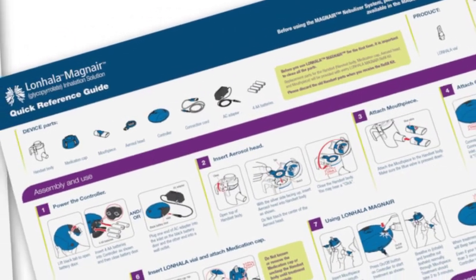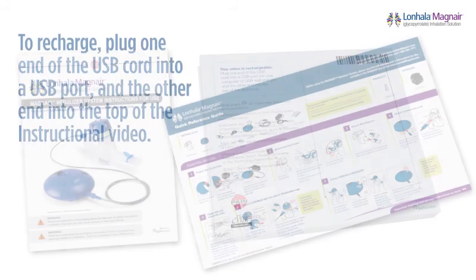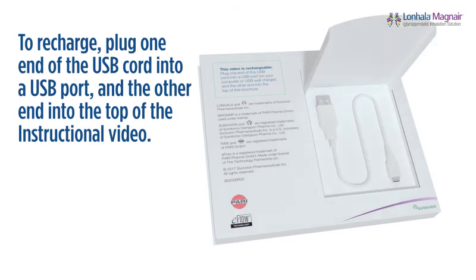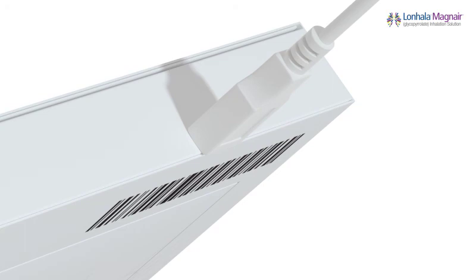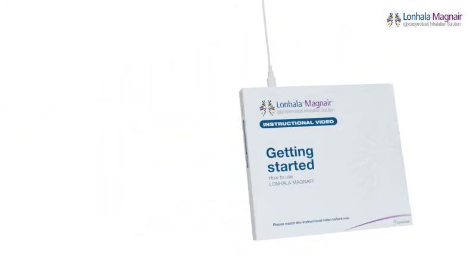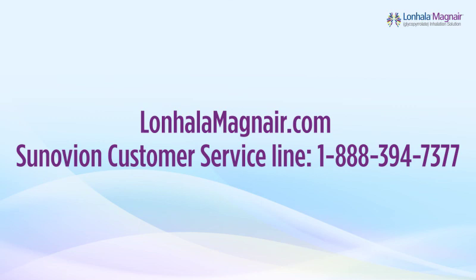Thank you for taking the time to watch this instructional video. You can always watch again or use the quick reference guide available in the Magnair box. Be sure to read and follow the full manufacturer's instructions for use, also included in the Magnair box. To recharge this instructional video, open the compartment on the back and retrieve the USB cord inside. Plug one end of the USB cord into a USB port on your computer or USB wall charger, and the other end into the top of the instructional video. It may take up to 45 minutes to fully recharge the instructional video. You can track charging progress on the video screen while it is plugged in. When charging is complete, store the USB cord in the compartment on the back of the instructional video. If you have questions or need help with your Lonhala Magnair, please visit LonhalaMagnair.com or call the Sunovion customer service line.